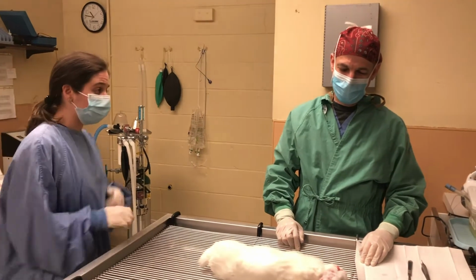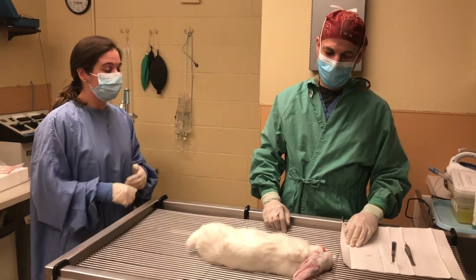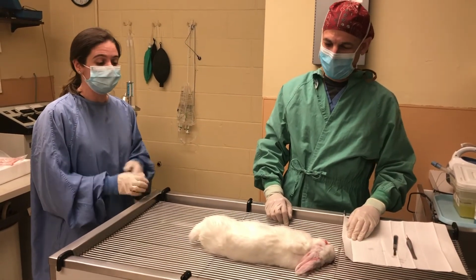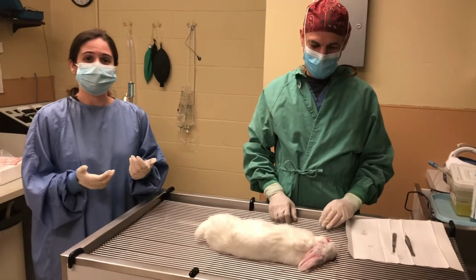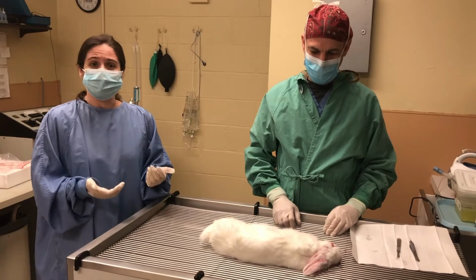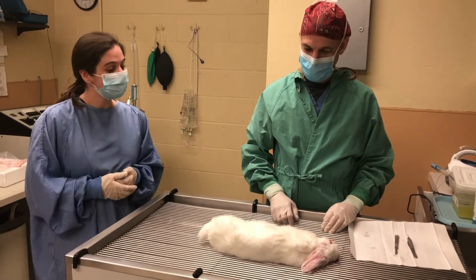So the first thing Dr. Goldman is going to do is perform an external examination on the animal. And basically he's just going to look it over, see if there's any lesions, any injuries, anything abnormal that might have contributed to the animal's death.